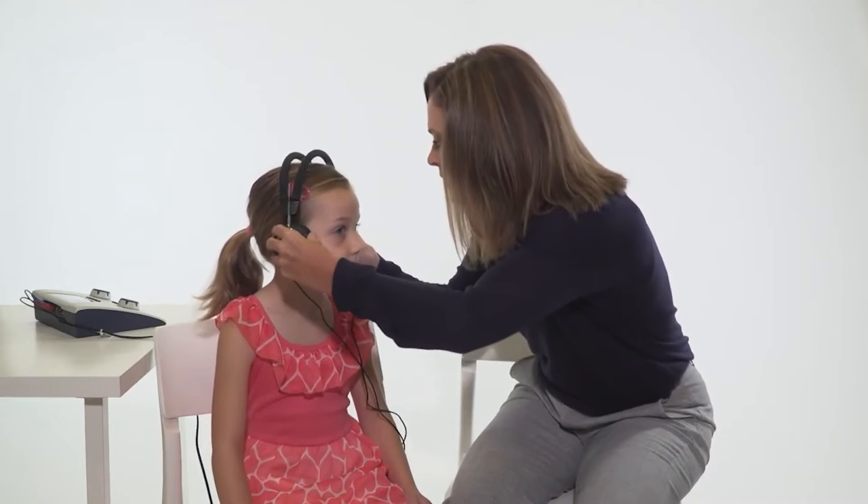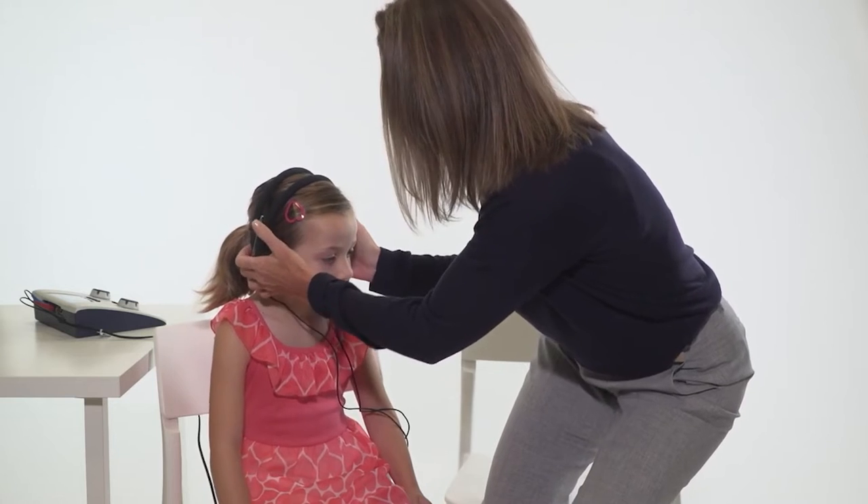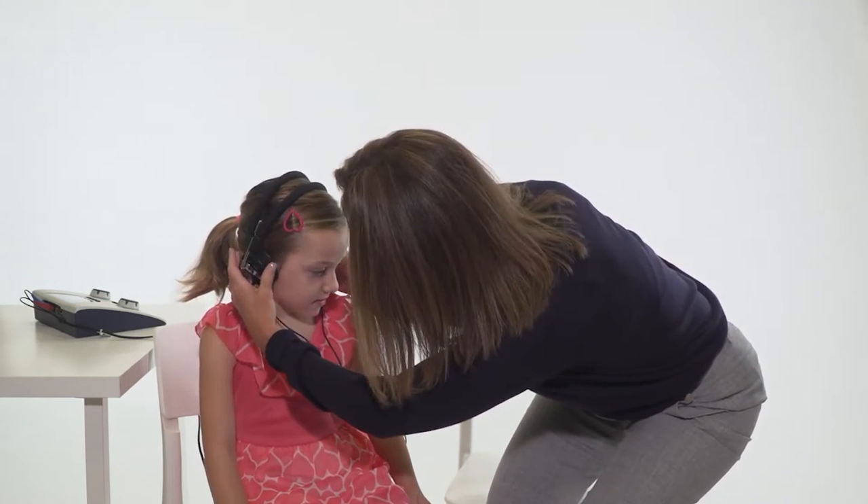Place the headphones directly over the child's ears with the red phone on the right ear and blue on the left. Remove any obstructions that may interfere or be uncomfortable, such as glasses.